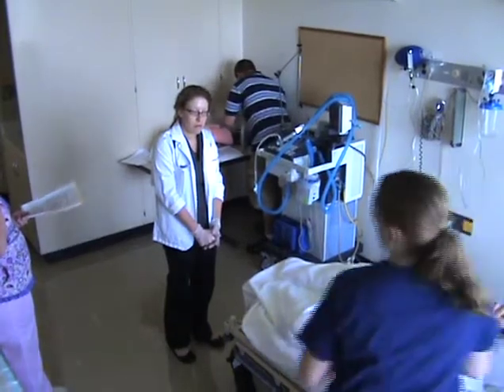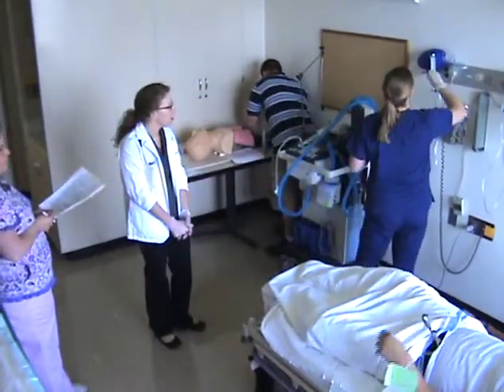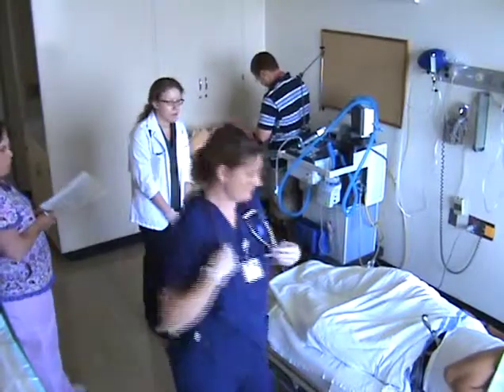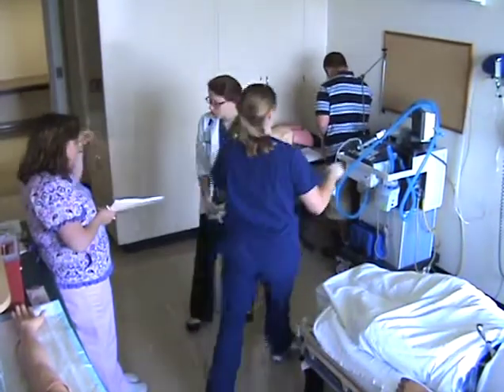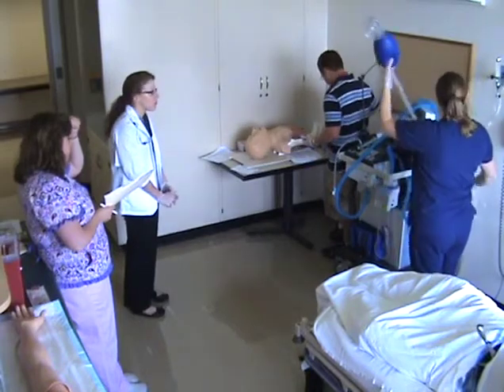The non-rebreather's not doing much. Even if it's turned on, it's not helping him. So what should we do if the oxygen is not helping him? Bag him. Okay, so y'all go ahead and do that with the mannequin. You want to show Jaden how to do that while he's getting his stuff ready.